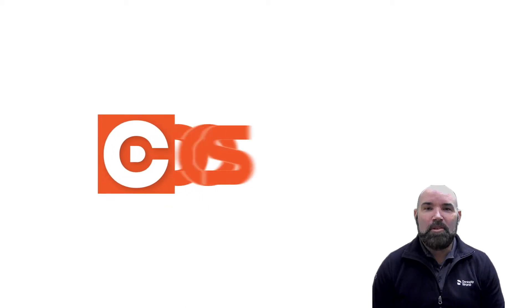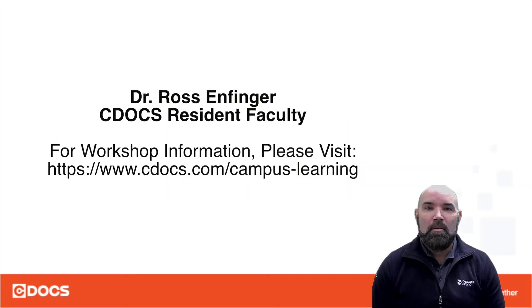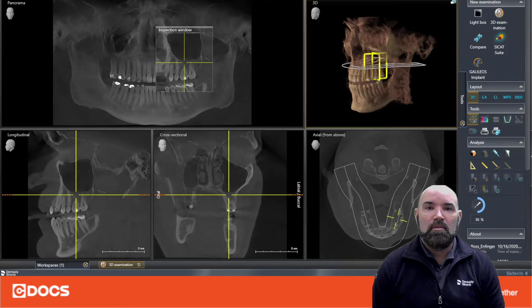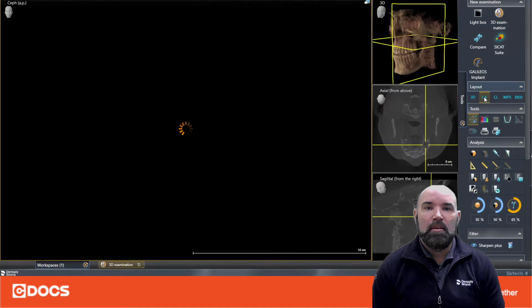Hi and welcome to the Conebeam Tip of the Day for C-Docs. My name is Ross Enfinger and in today's video I'm going to be reviewing the layouts in Sidexis 4. We're looking at an Axeos scan — this is a 17 by 13 full volume scan — and we're going to look at the different layouts that are possible with Sidexis.